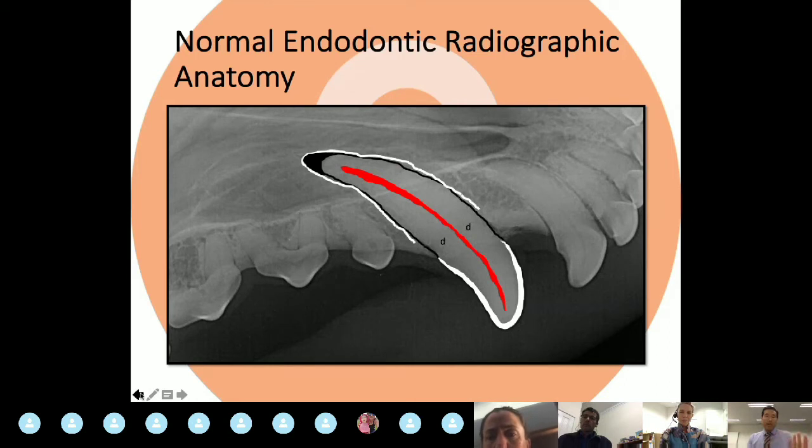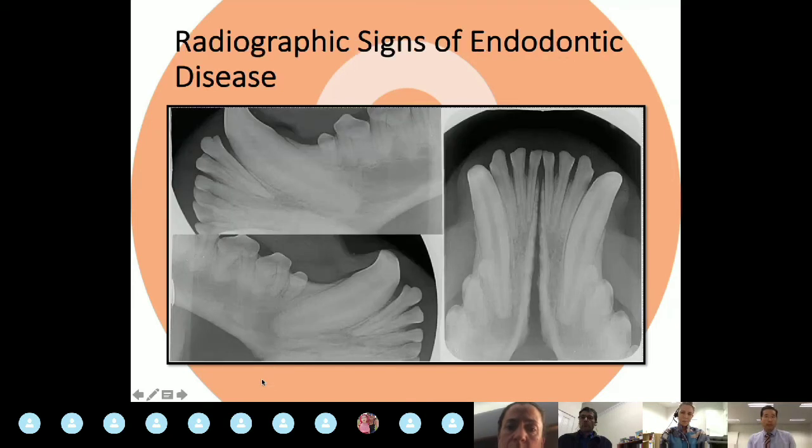That black pointy thing is actually a chevron lucency. That's just a thickening of the periodontal ligament at the apex of the tooth where the blood vessels enter the tooth. And it's a structurally normal entity in certain teeth. Lastly, we've got trabecular alveolar bone and cortical alveolar bone on the more coronal aspect of that tooth.